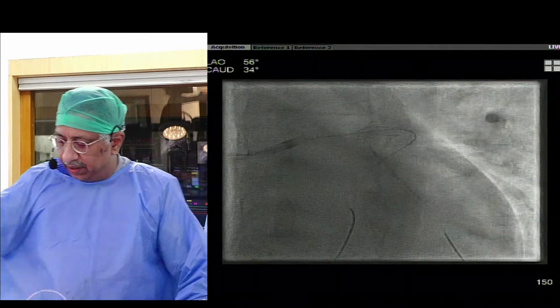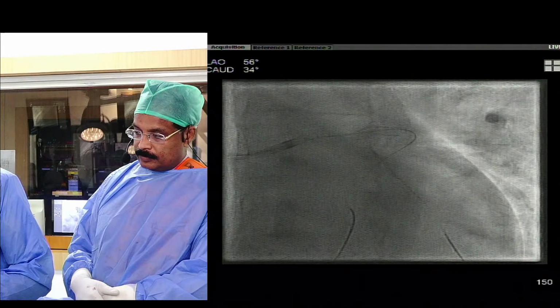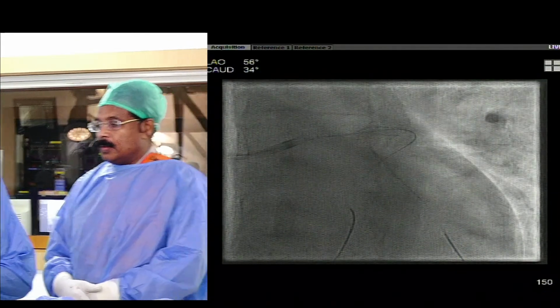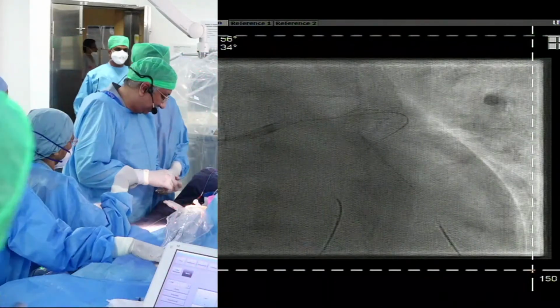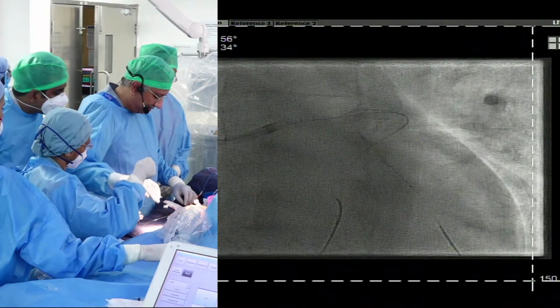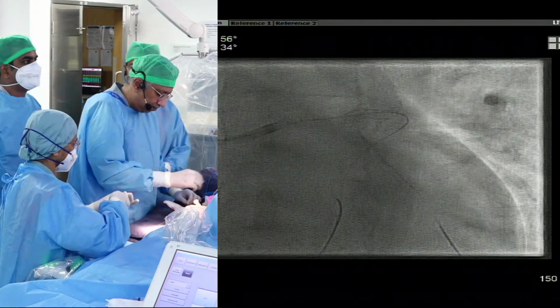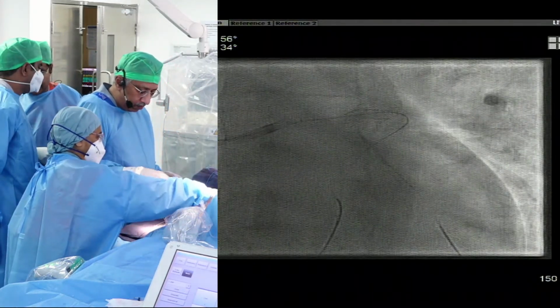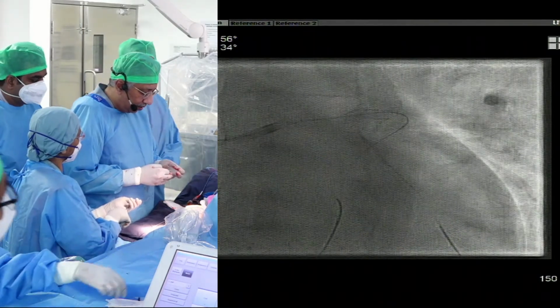So what do you do with these patients? We've used many techniques. One thing is clear, 30 minutes is too less. Physiology, imaging, everything. We've used suction catheters, everything, but we changed our strategies of late. And here we use thrombolysis, and this is a standard procedure for large thrombosis that we use.